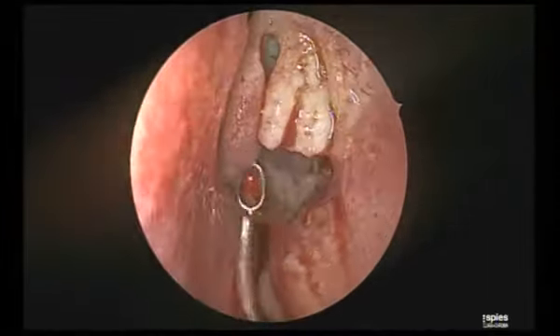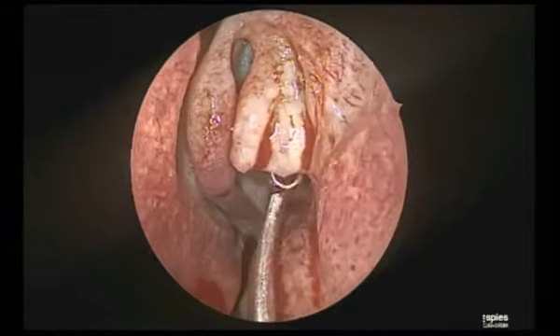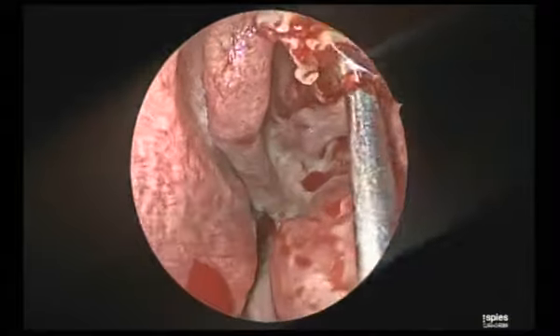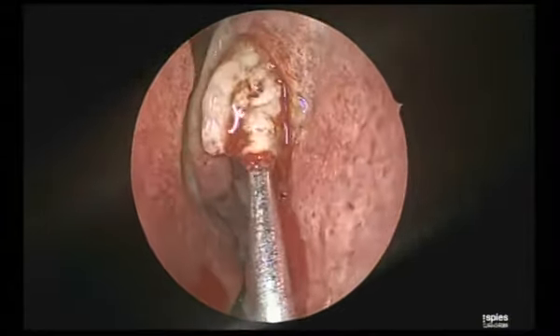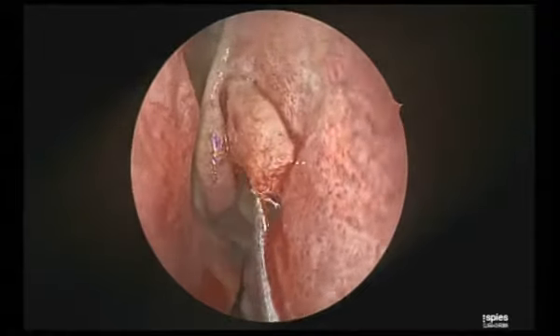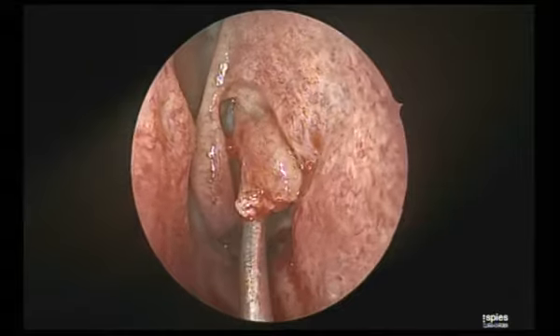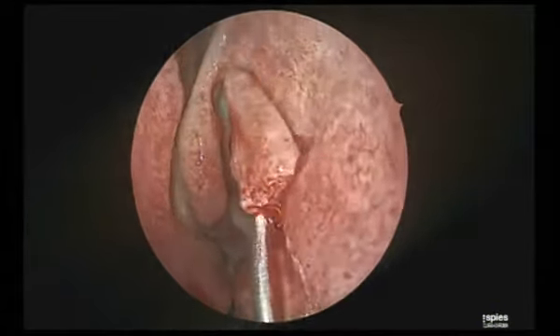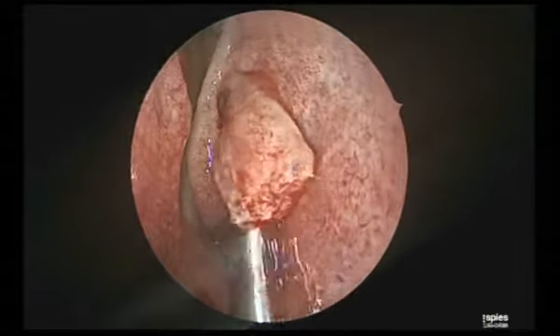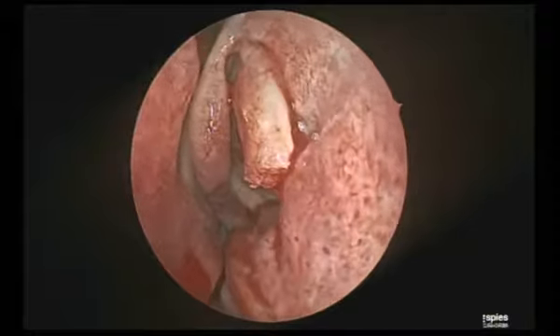See now, frontal now, very important step, the upper part of the uncinate. Again, you have many ways to remove it. For the junior colleague, the simplest way is go in the hiatus semilunaris. See the bulla behind? Go into hiatus semilunaris with the angled probe. Go high up and you can fracture it, and he is mobilizing it to its anterior most limit. Gently there are strokes and you watch where the mucosa will stop moving. See this? It's draped on the thick wall. Now you can take away by the through biting.